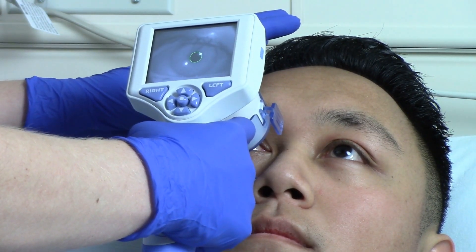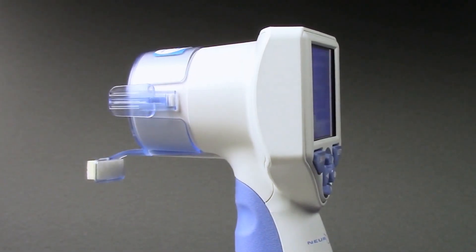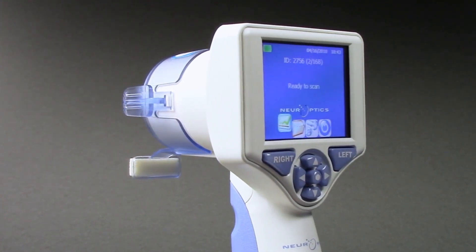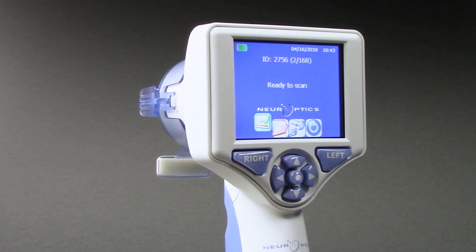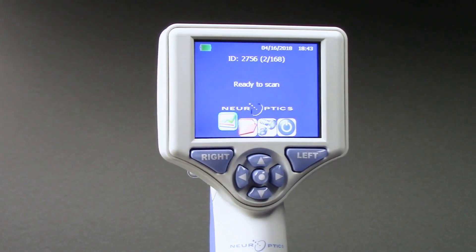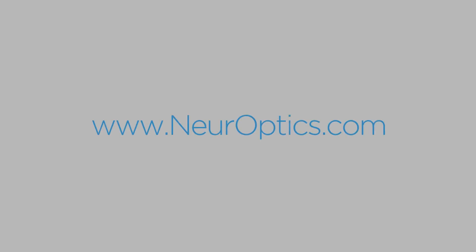Automated pupilometry provides accurate, reliable, and objective pupil measurement independent of the examiner. By removing subjectivity from pupillary evaluation, the NPI 200 pupilometer provides benefits to clinicians and patients through its ability to detect subtle pupil changes and to trend these changes over time, improving patient care. For more information about the NPI 200 pupilometer system, including instructions for use, cleaning instructions, and clinical publications pertaining to pupillometry, please go to our website at Neuroptics.com. To contact your local representative, email us at info@Neuroptics.com.